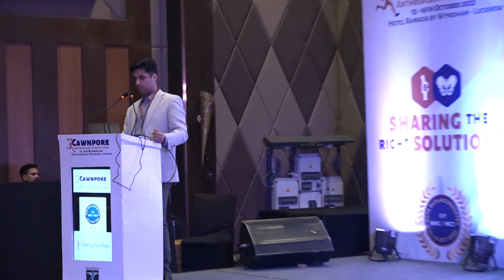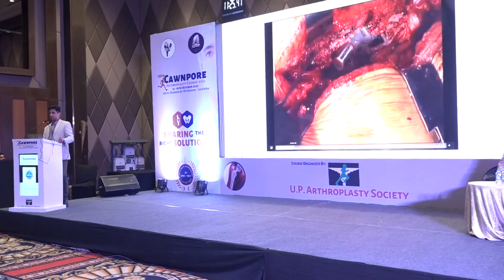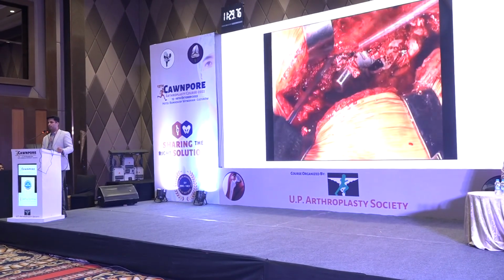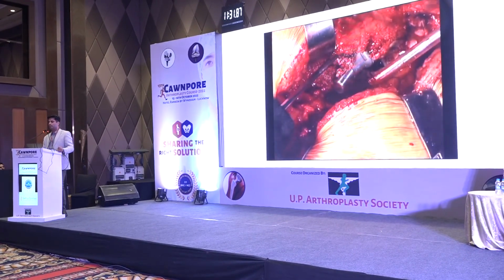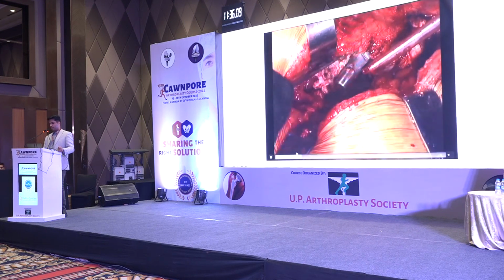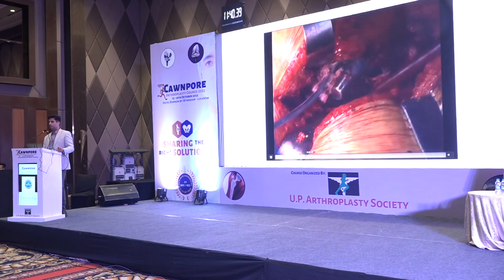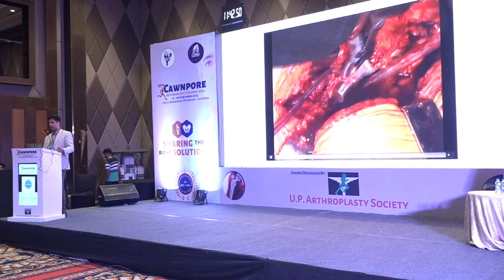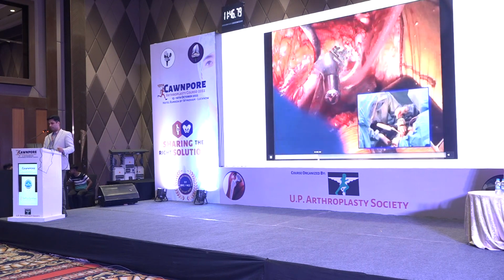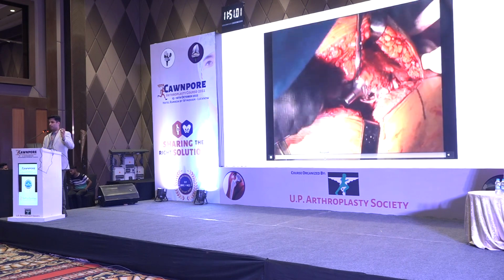Yeah. So Dr. Luca Marega is just going to show us a few different ways to remove it. Again, he's removed the granulation tissue and the loose bone around the neck of the prosthesis, and the stem is just visible there. After that, using burrs and small instruments, he clears up the space to pass in thin flexible osteotomes or drill bits down by the side of the canal, all the time making sure you have pulsatile lavage to clean it off.